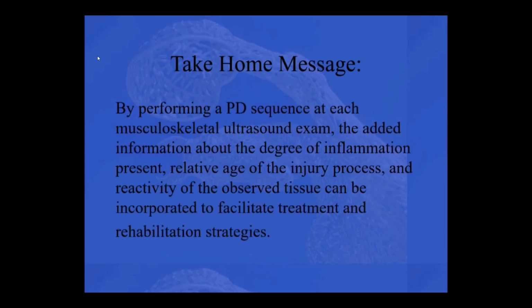And by performing PD sequences at each musculoskeletal ultrasound exam, we get so much more information you otherwise would miss. So I would really say, look into it. If you have it on your machine, look if you're accurate with using it. It's a very good tool. I'm very happy with it.